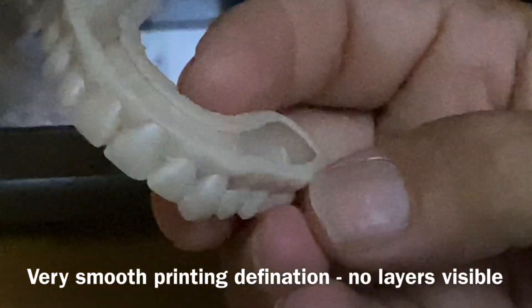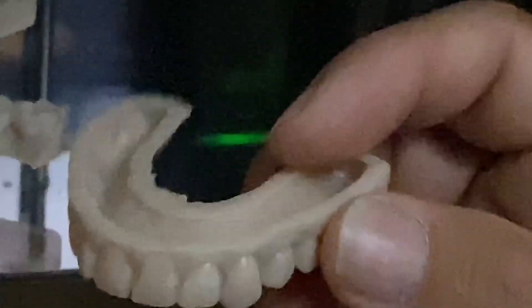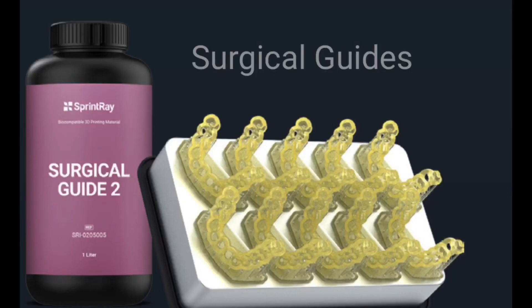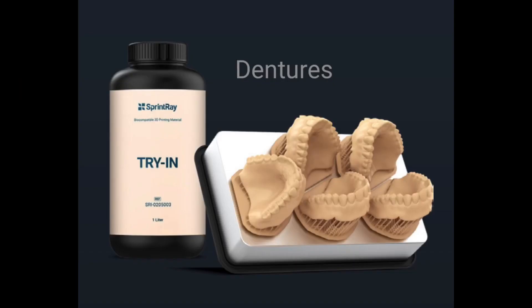We make hollowed models just to save on material. You can also choose hollow versus solid - that's done in the software. When you're in your CAD design and sending it off to the Sprintray software, you make that choice in your CAD design.